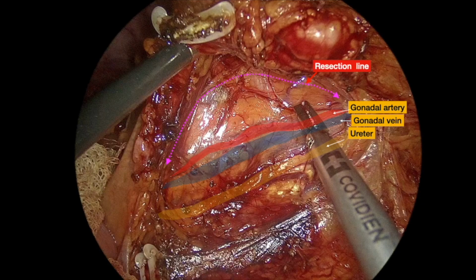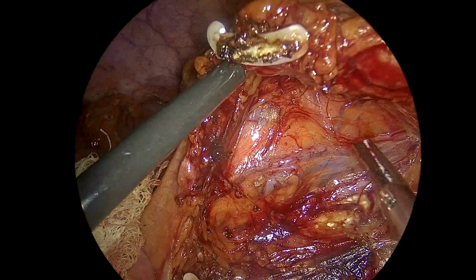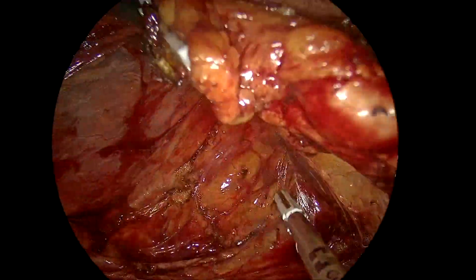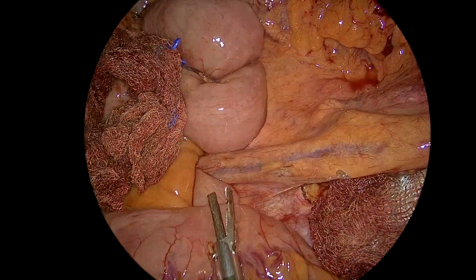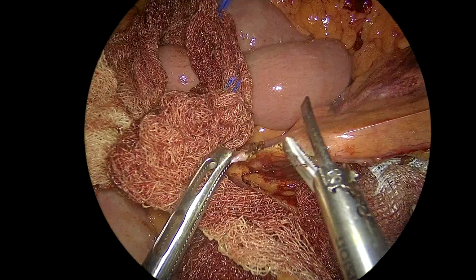The mesentery of the sigmoid was dissected and the left ureter and gonadal vessel clearly identified. The sigmoid mesentery was dissected bluntly away from the retroperitoneum. The IMV is divided in a similar manner to the IMA.